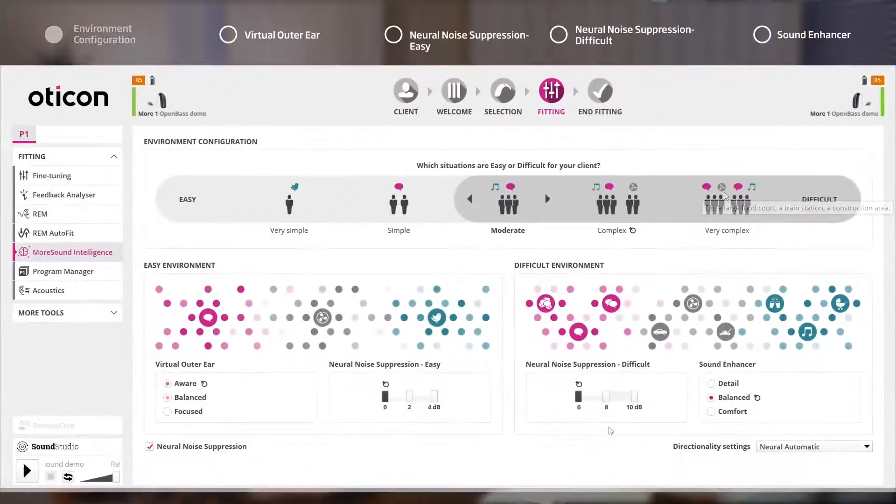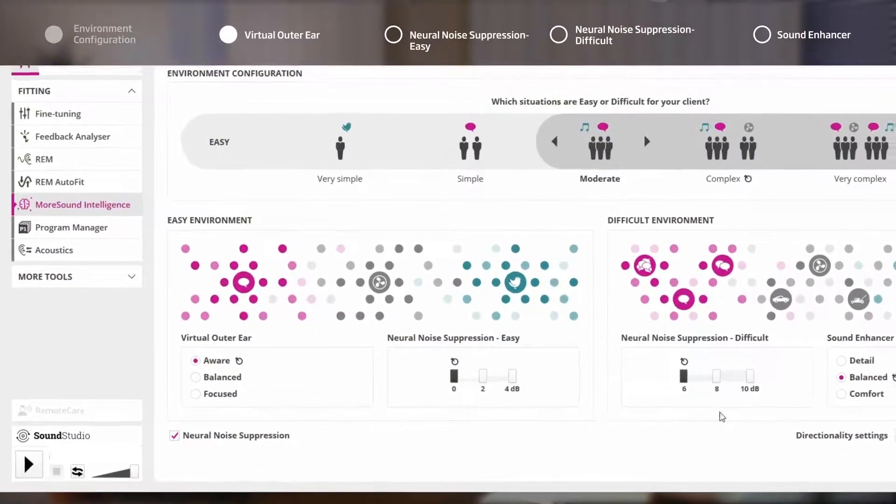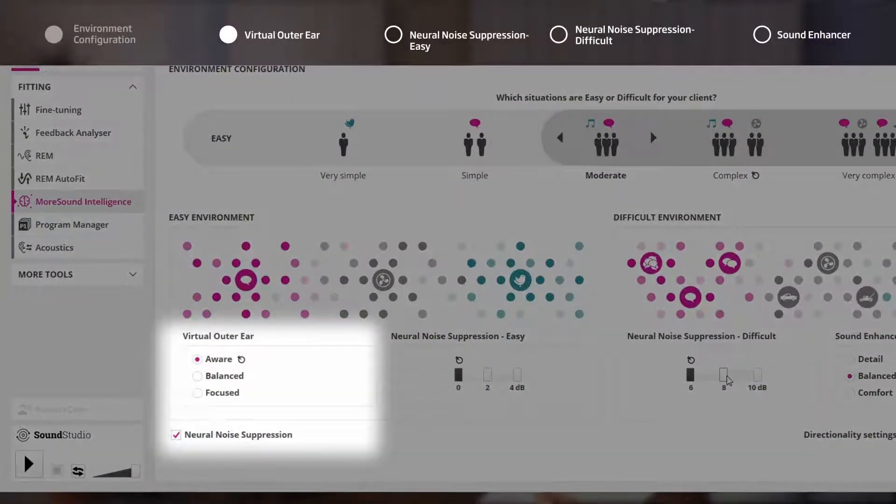As Rachel is not experiencing much difficulty in simple situations, Virtual Outer Ear will be left as Aware. If Rachel was struggling to hear even in easy listening environments, Focus setting could be considered which would allow more focus on speech from the front while keeping access to all surrounding sound scene.